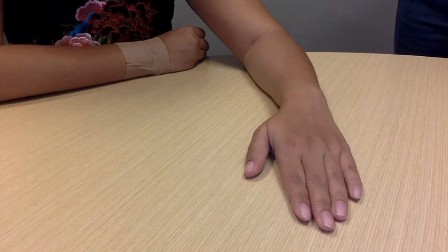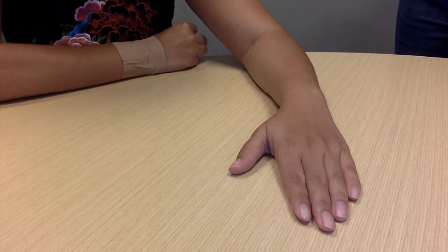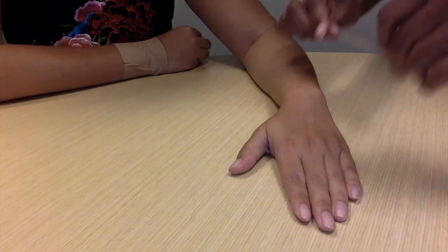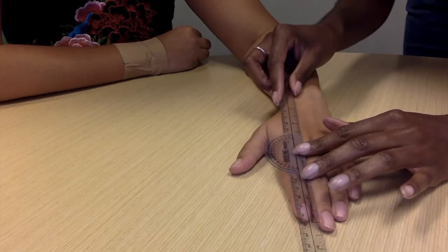For MP abduction, the normal range is 0 to 25 degrees. The patient is seated with the forearm pronated, the wrist at 0 degrees in neutral deviation, the fingers straight, and the hand resting on a firm surface. The axis is centered over the MP joint being measured. The stationary arm is over the corresponding metacarpal. The movable arm is over the proximal phalanx.